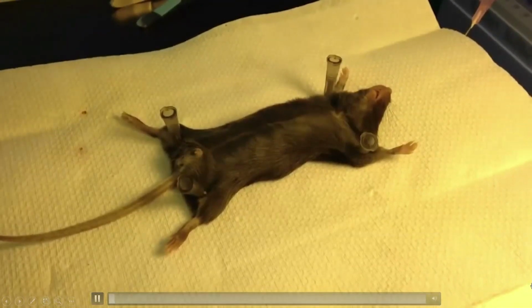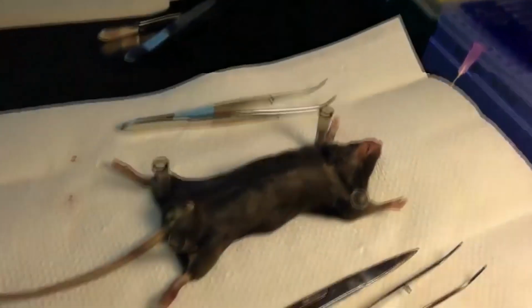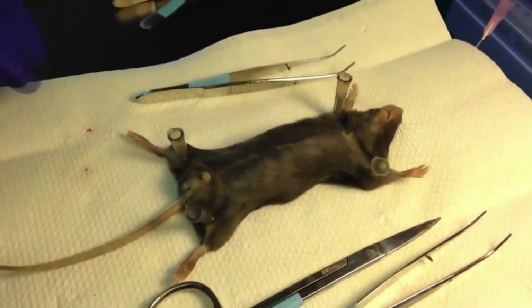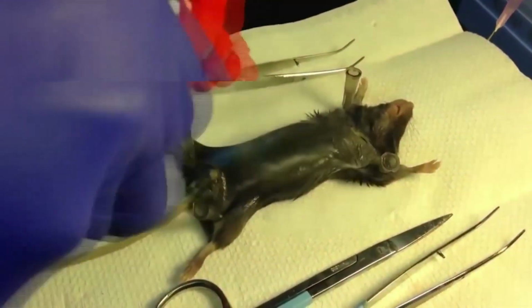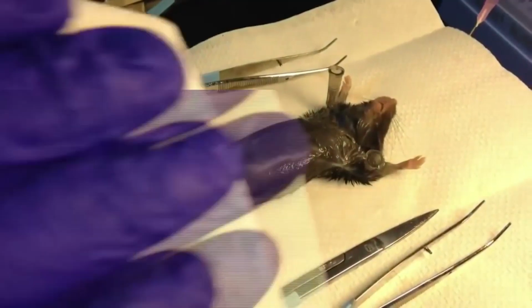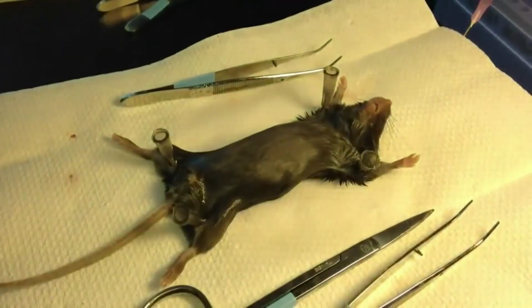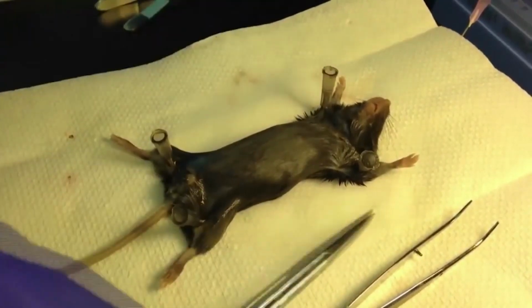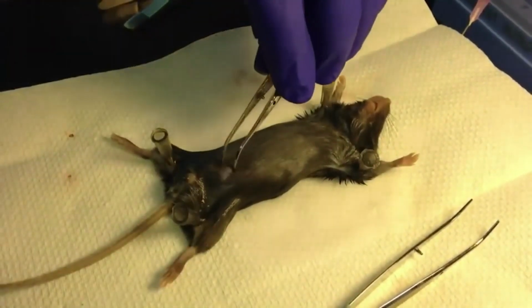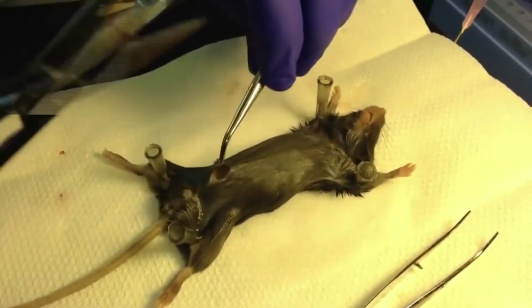Okay, so for today's extraction, you're going to need 2 sets of forceps and a small pair of scissors. Okay. So first pin the mouse to the board, spray it down with 70% ethanol and give it a nice little wipe. This is so that the fur doesn't stick to your scissors as much. And then what we do is pull the skin up and make an incision at the bottom.